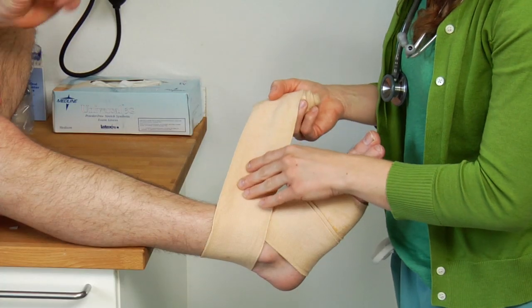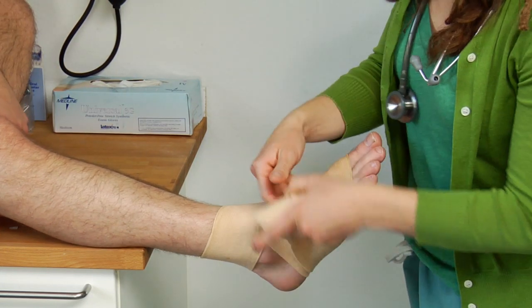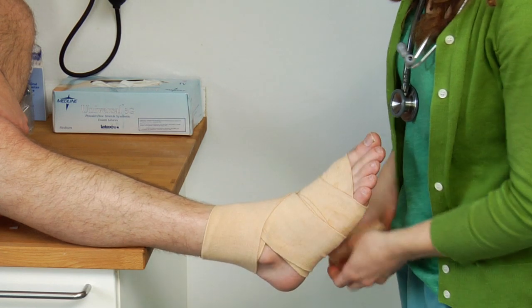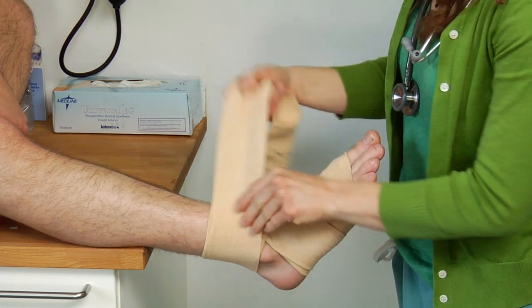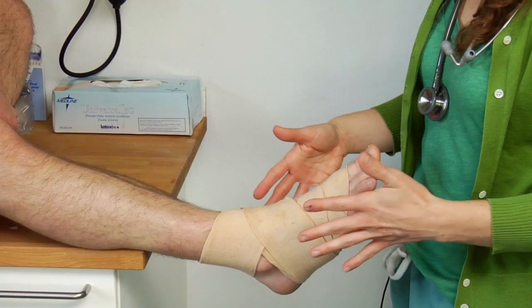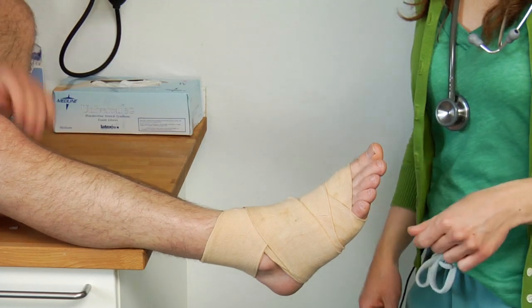This is something you're going to have to work as a team with the patient to make sure that you're getting the support in the right area, that they're not feeling any numbness or tingling, and that they're feeling the right sort of support. You might actually have to go back and rewrap. The point is not to get it done in the quickest amount of time or to have the prettiest wrap, but to have a wrap that's actually supportive for the ankle and going to help prevent any further injury. So make sure when you're done, you ask your patient: does that feel okay? Do you have any numbness or tingling? And does it feel like it has support? And that's how you support your ankle with a wrap.